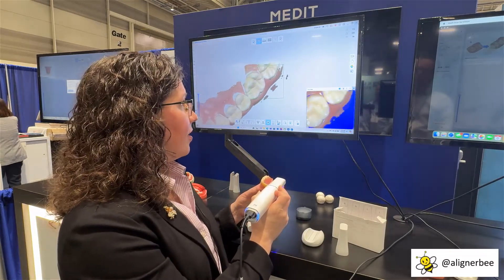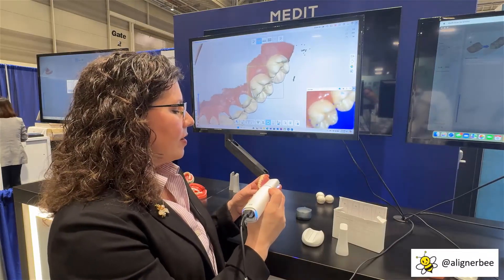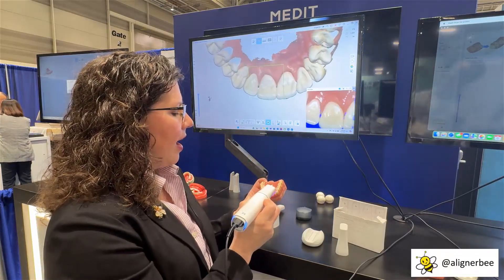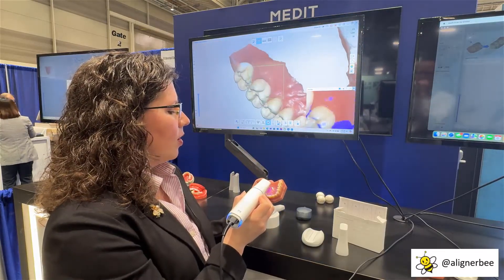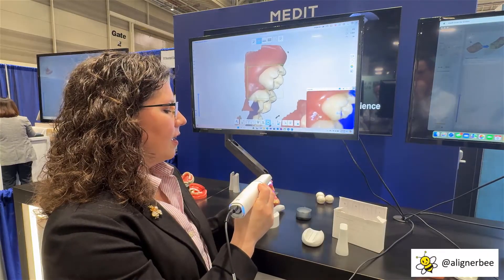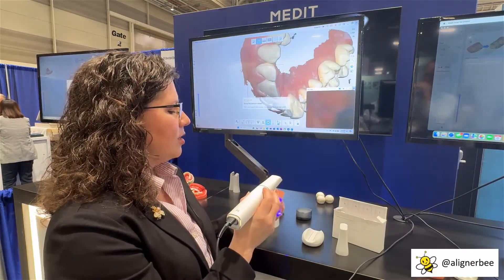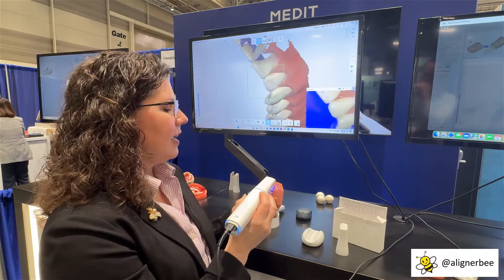As you can see, the scanner is scanning very quickly and very smoothly. There is about a one-second delay from when you activate the scanner to when it begins recording, and that's to allow you to position it in the mouth without capturing artifacts. As we can see, there is a very smooth scan, and we're able to reposition quickly and easily.